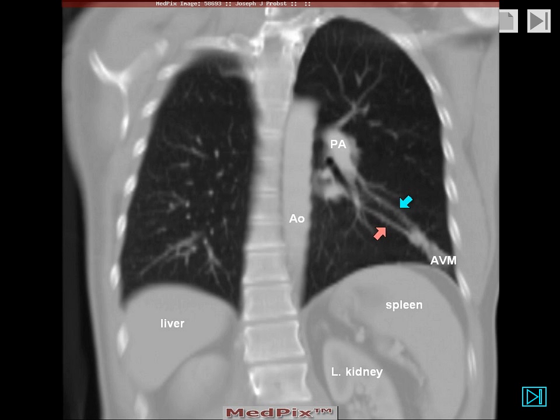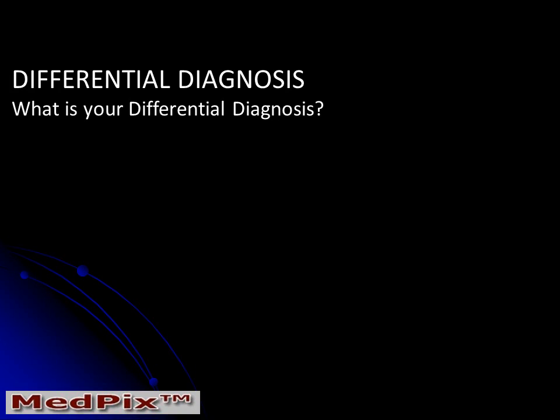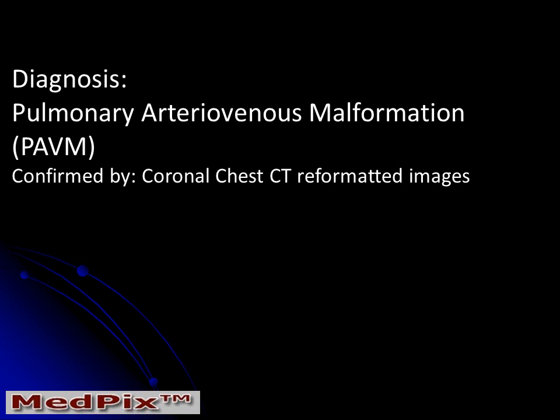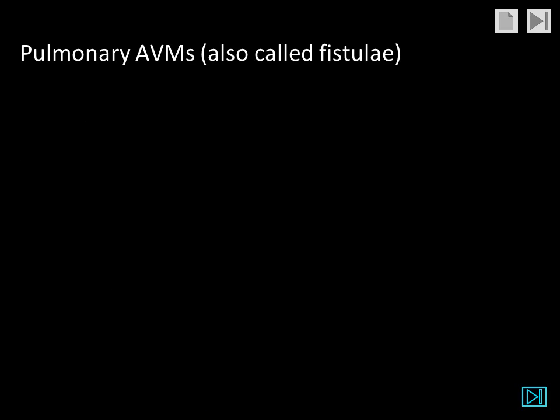Now we have to give a differential diagnosis. This most likely represents a pulmonary arteriovenous malformation. One of the linear opacities is probably a pulmonary artery and the other is probably a pulmonary vein, connected by a pulmonary arteriovenous malformation. Because of the information from the coronal CT, we have a relatively limited differential diagnosis of a pulmonary AVM.